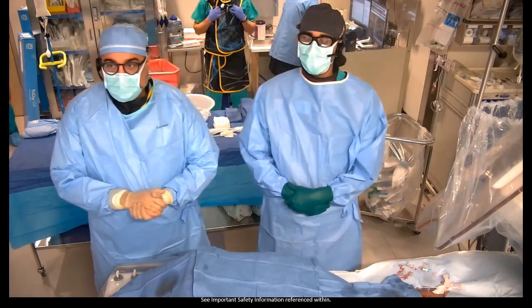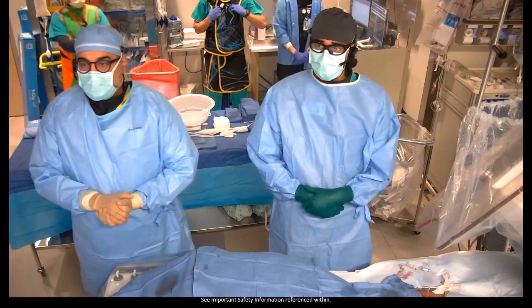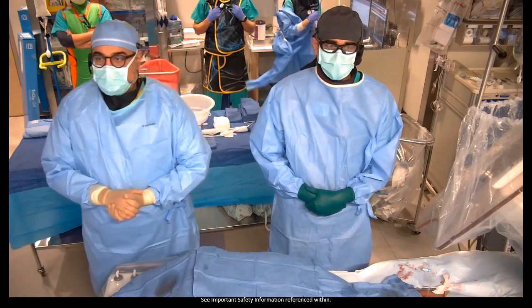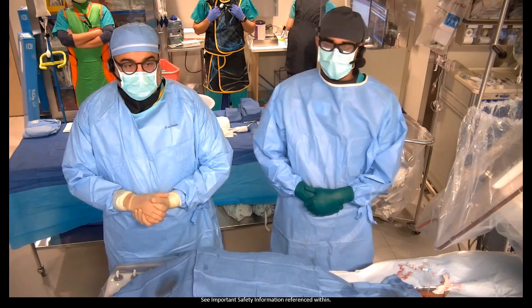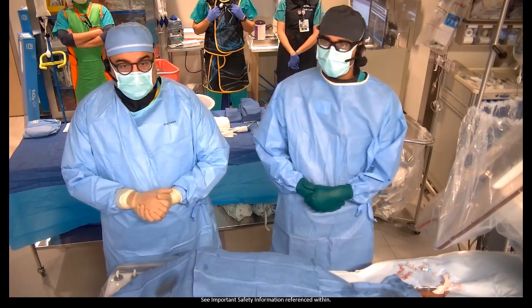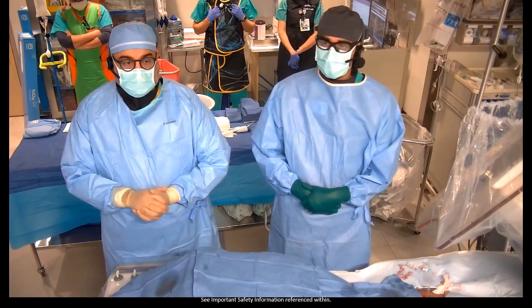So this is a 78-year-old male. He has a history of coronary disease, had a prior CABG many years ago, as well as diabetes, a prior stroke, and he's relatively frail. He's been admitted to the hospital two or three times in the past few months with acute decompensated heart failure. He has multiple issues: mildly reduced LV and RV systolic function, mild to moderate MR, and low gradient AS, which we worked up with a valve study that showed that wasn't really the problem. We're left with severe TR as probably the most addressable cause for his heart failure admissions.